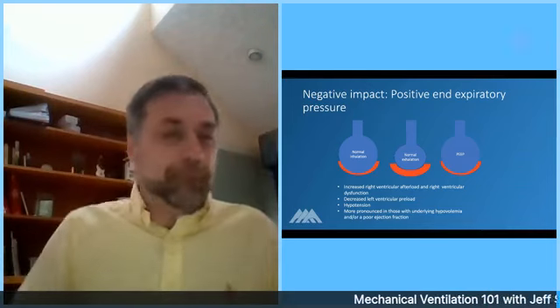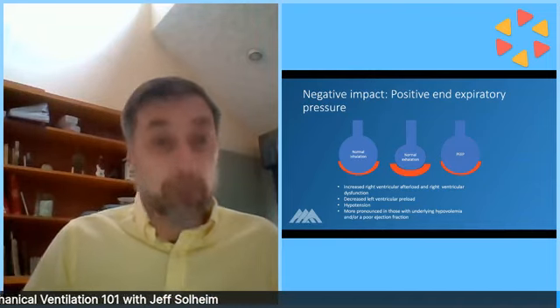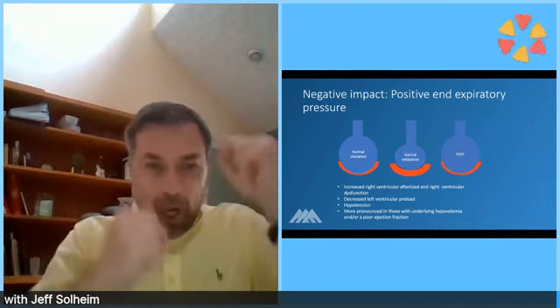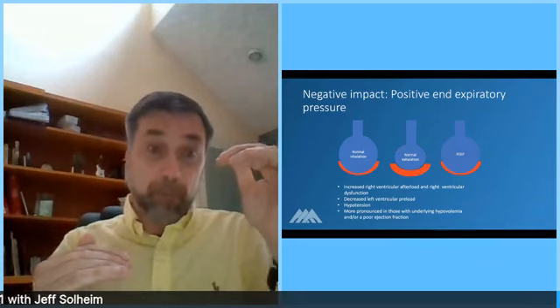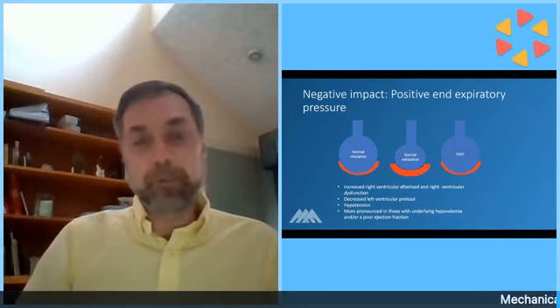I always think of what my chief flight nurse tells me. He always says, when you're working with a ventilated patient, if you're not adjusting your ventilator every 30 minutes, you're not managing your patient. So it's that constant movement of the blood pressure, the FiO2, the PEEP, and you're managing them all together and looking at the blood gases to try to get the FiO2 at the lowest level possible and the PEEP at the lowest level possible with a manageable PaO2.